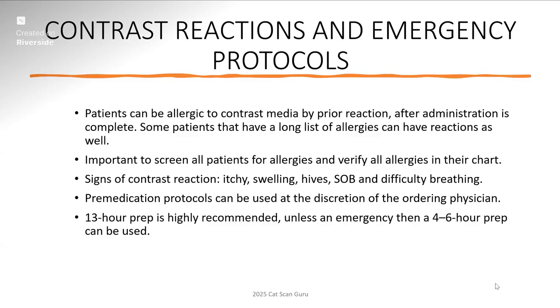Typically, we do a 13-hour prep. That is what's highly recommended. Unless the patient's in the ER, then a 4 to 6 hour prep can be used. If you deviate from any one of those, I would get your radiologist involved and have them talk to the ordering physician, because we have to be extremely careful, especially if patients have anaphylaxis.